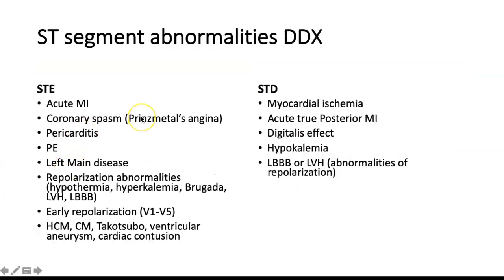ST segment abnormalities can happen both with and without ischemia, and the differential diagnosis list is quite lengthy.